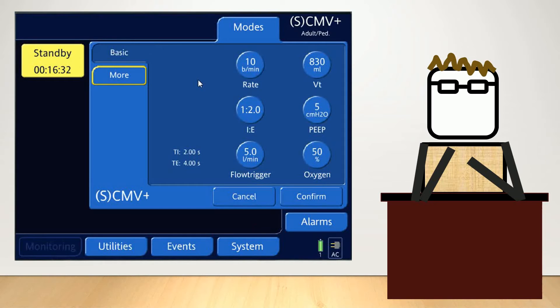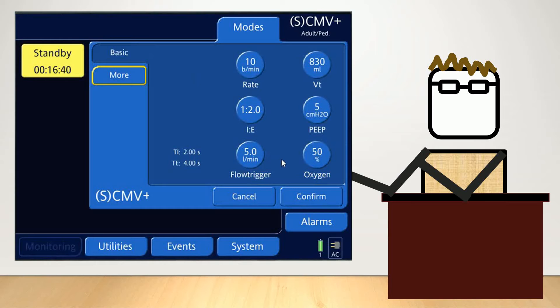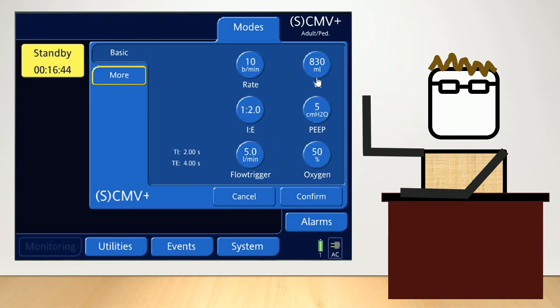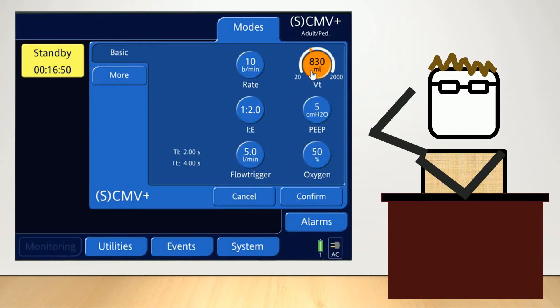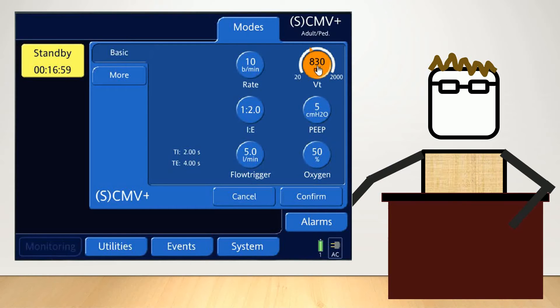So in this case, we're going to set the tidal volume first, and this is the control variable. The average ballpark tidal volume that you would like to set as a baseline is about 8 milliliters per kilogram. So for me, at about 80 kilograms, I'm going to go with 640 milliliters as my tidal volume.